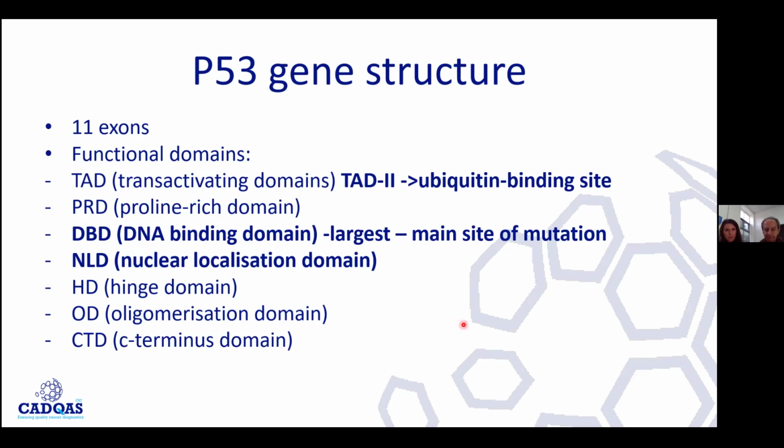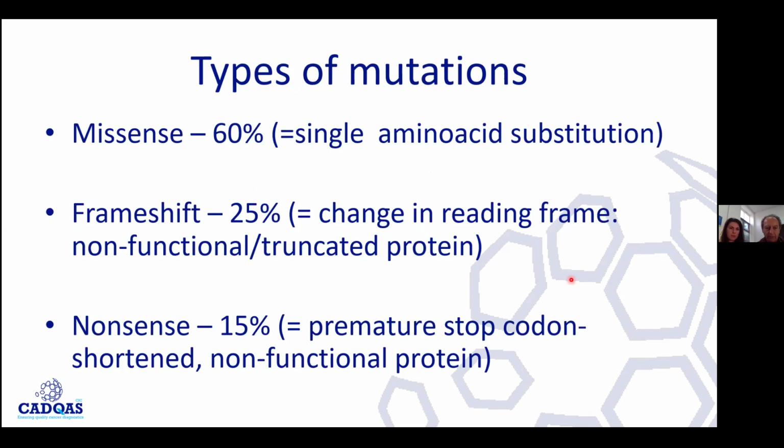So you might have a big chunk of the tumor completely negative, and I think these are the nuances that we need to learn and understand more. When can you stick your neck out and say, well, I think this is a mutant pattern? How much can you rely on this? So I think we've already gone into this.